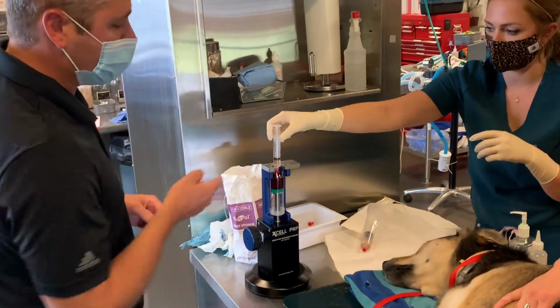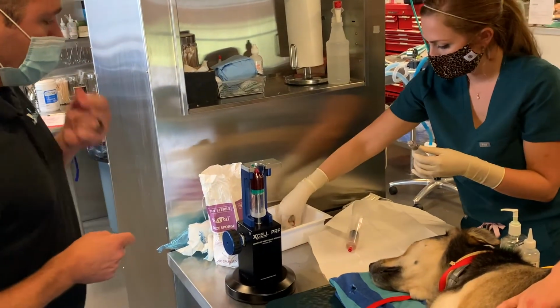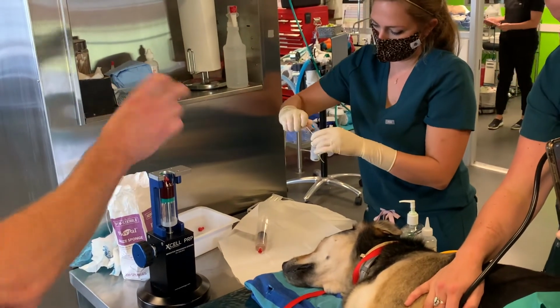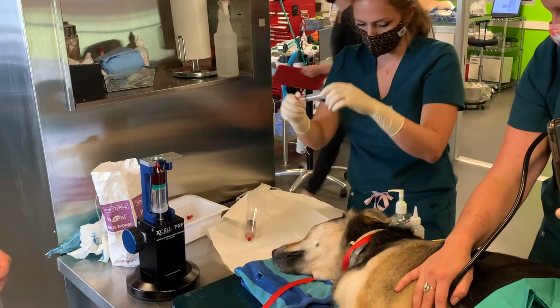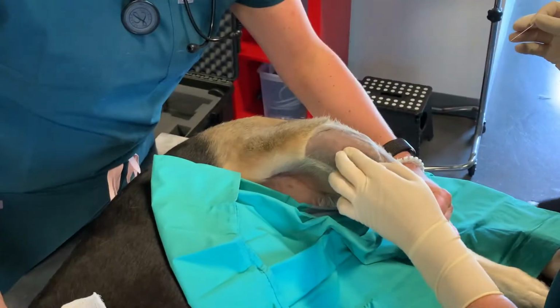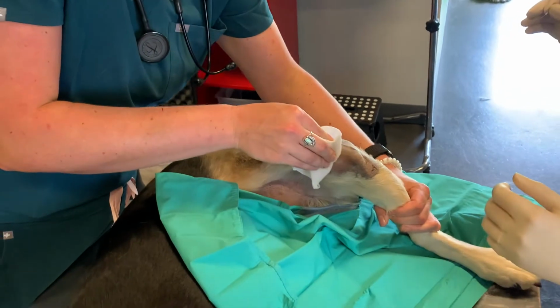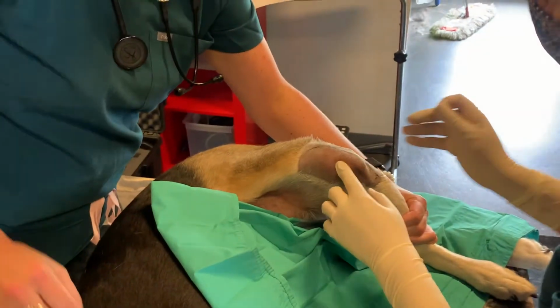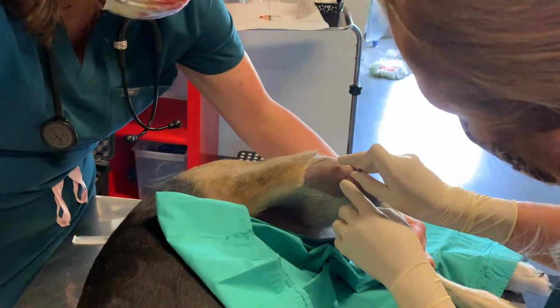So I should take this off? Take that off? Because I want it to say Sarah. And then put one of those other red caps on, and then just gently mix it around, and now you're ready for injection. Okay. Cool. All right. With the needle first? Okay, cool. You want to wipe there? Yeah. 22, 1.5 for the stifle. All right. I'm going to go ahead and.